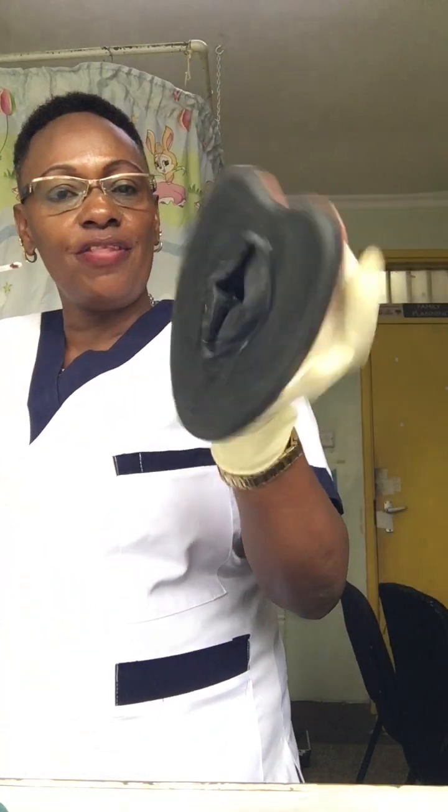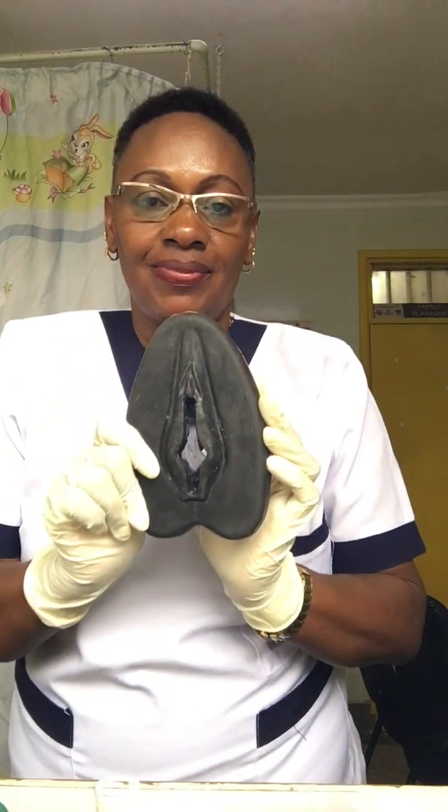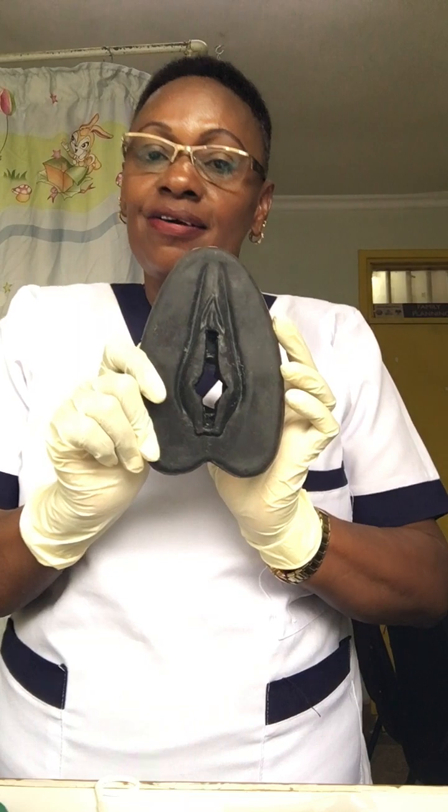So this is inserted through the vagina. I've shown you the vagina. This patient is now lying in lithotomy position. Lithotomy position is when a person lies on the back, facing upward, and the legs are wide apart. The client must be in a relaxed mode to make it easier for the insertion.